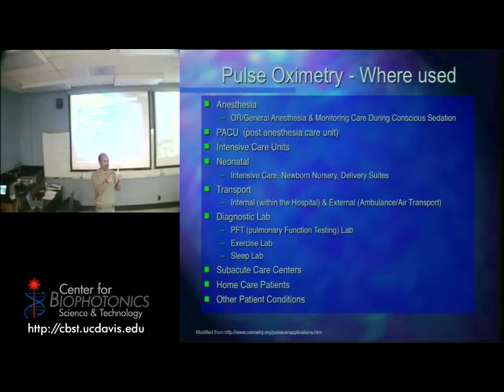All they're doing is supplying power and getting a reading out of here. So there are the LEDs in there. Both LEDs are in there. And the photodetector is in there. Okay? So take a look. Here, I'll pass it this way.